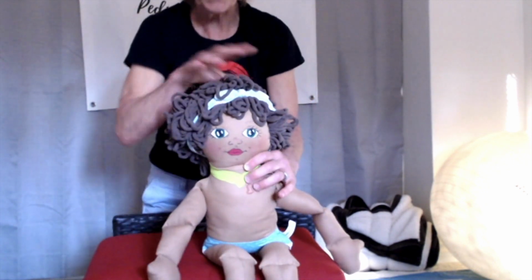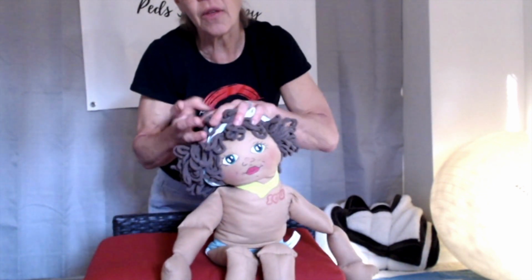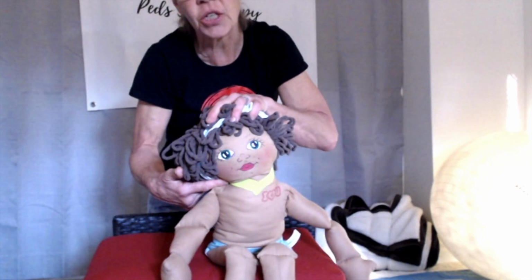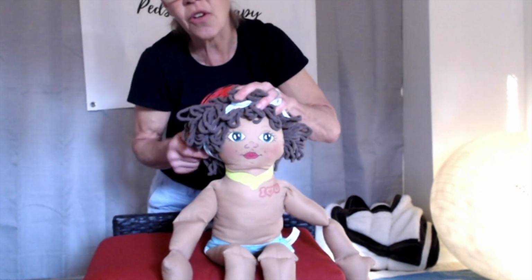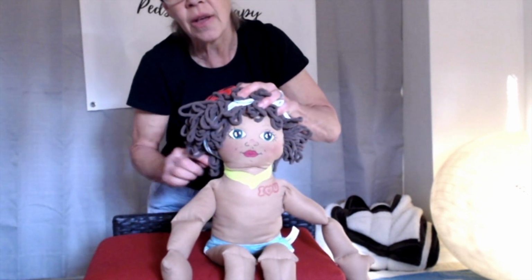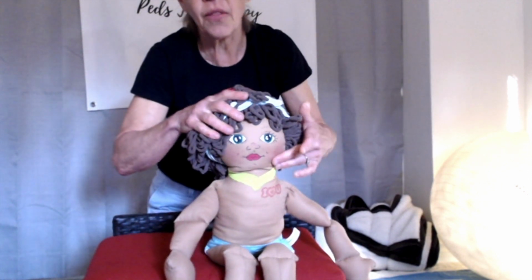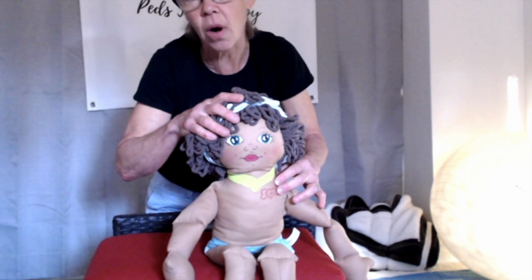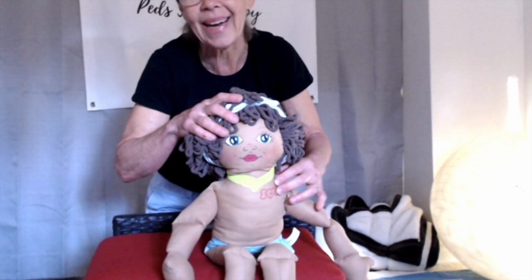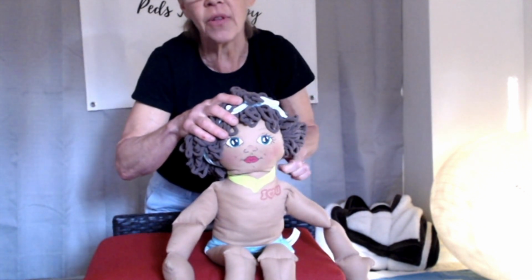So review. Right-sided torticollis. This right SCM is working too much. I want it to relax. I'm going to start my tape at the insertion and take it down to the origin. But then on the other side, I'm assuming the left-sided SCM needs to work harder. I want to turn it on. I'm going to start at the origin. I'm going to take it up to the insertion.